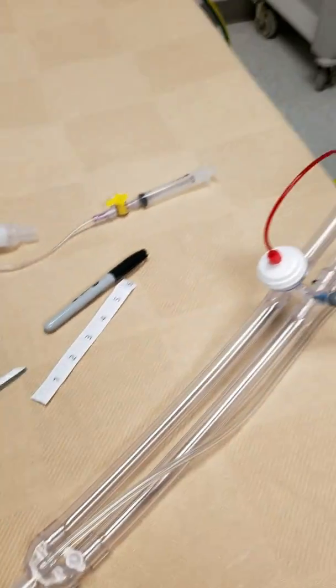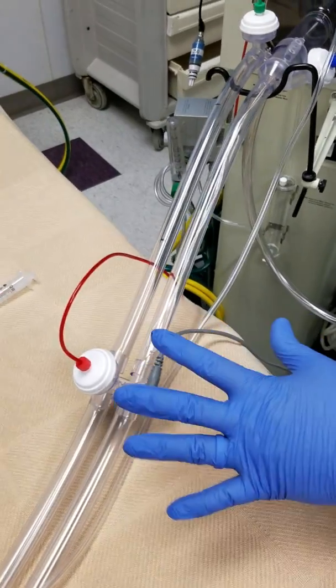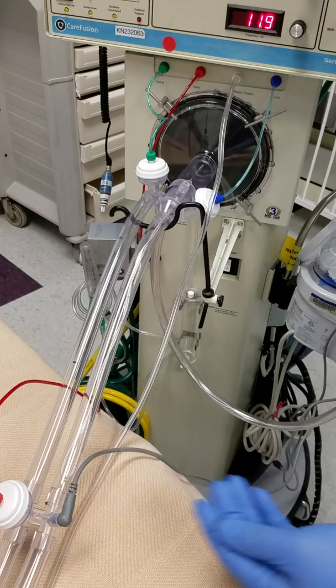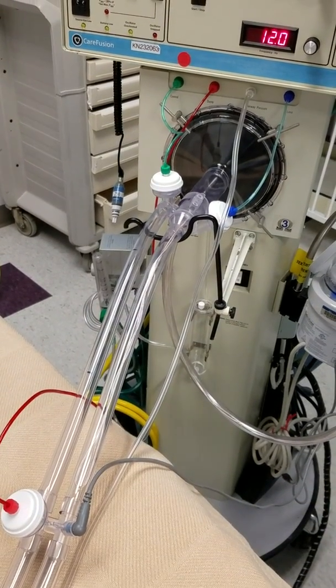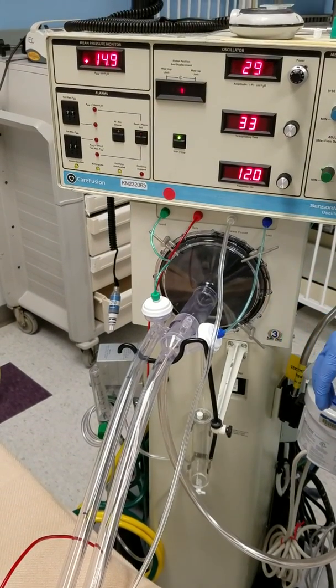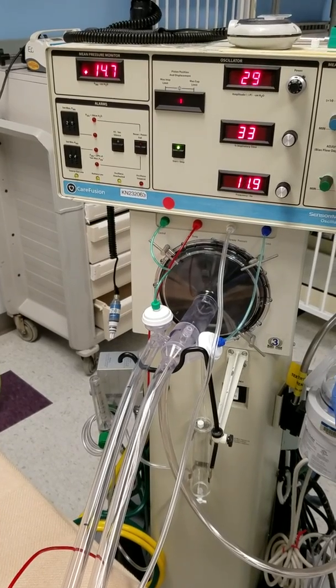Now the steps on how to do this safely while the patient is already on and suspected PUI or even active COVID-19 patient, and how to do it safely for our staff. The first step is you're going to have another therapist help you to bag/resuscitate the patient while we're doing it.